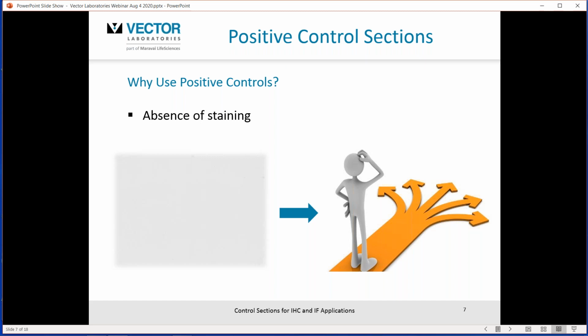Another key reason for running a positive control is in the circumstance where in fact you may obtain no staining or complete absence of staining. As I've shown here, you might be ending up scratching your head saying, gee whiz, what's gone wrong? And indeed, I've fielded inquiries like this from investigators saying, you know, I've had some great staining the last couple of months, everything's been going great. And this last week, I've got nothing, not even background staining, nothing, no trace staining.